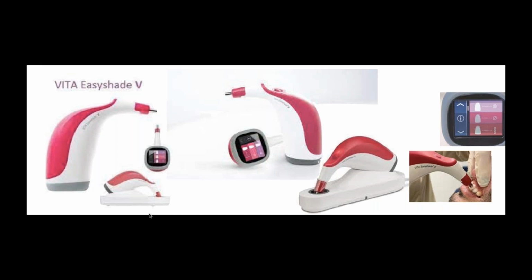I'm coming up with an equation. Once I'm done, I then go to my VITA Easy Shade and I take 1 or 2 photographs of the patient's teeth. And I'm hoping that my information and the Easy Shade information are going to match. If they do, it makes me feel very confident that I did the right thing. And I could also use that, by the way, to photograph my restoration at the end and see if I got to the value and the chroma that I wanted to. So I'm really personally using it more as a self-check to myself.